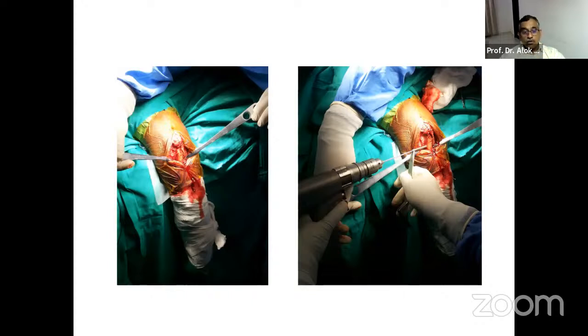You can see how beautifully soft tissue attachments of all the fragments have been preserved. At this juncture, you can take off slightly the lateral fibers of the anconeus and wash away all the hematoma from the joint with saline wash.